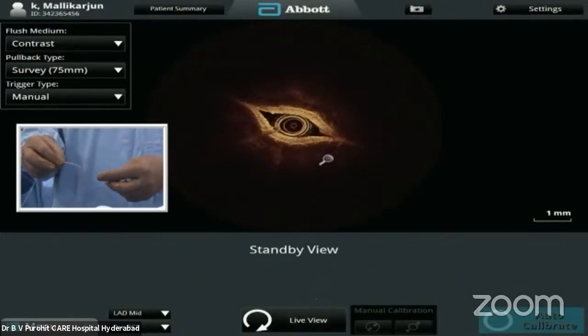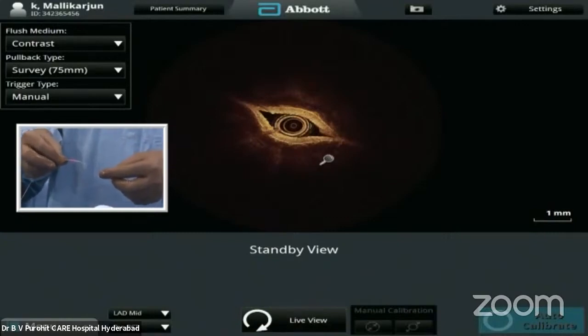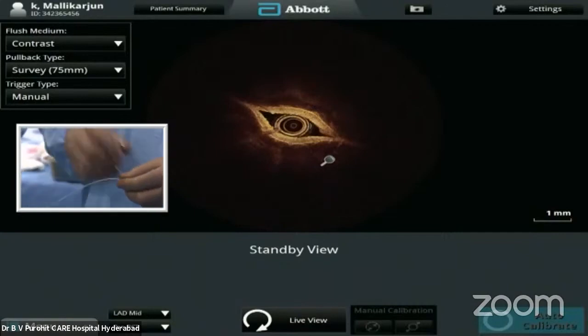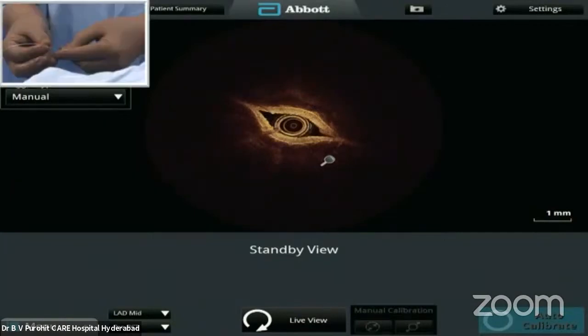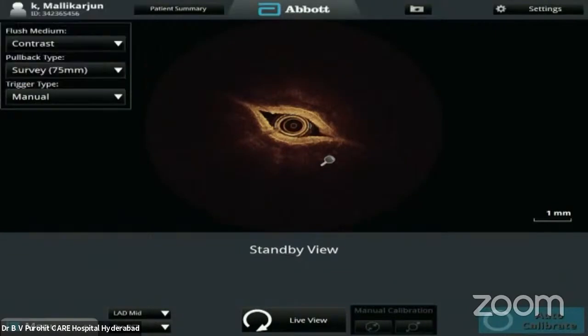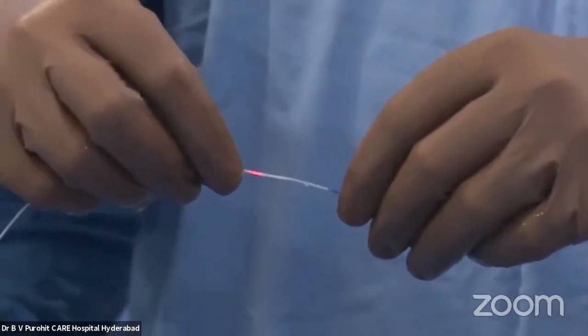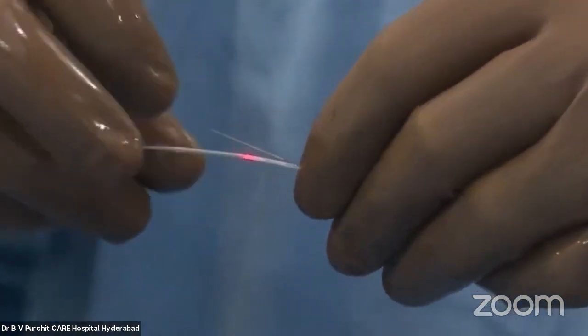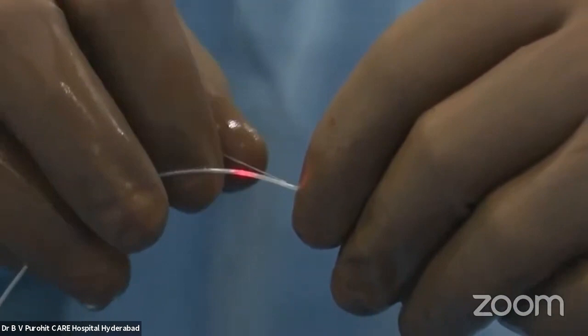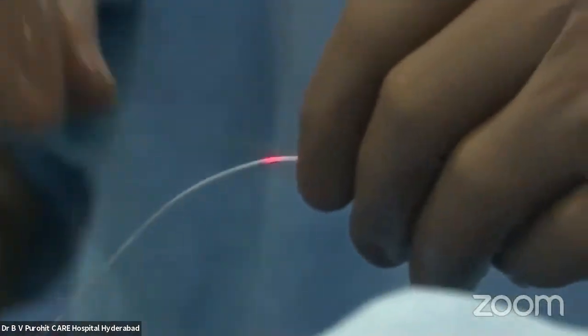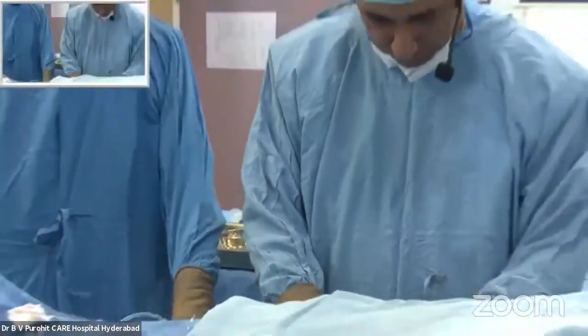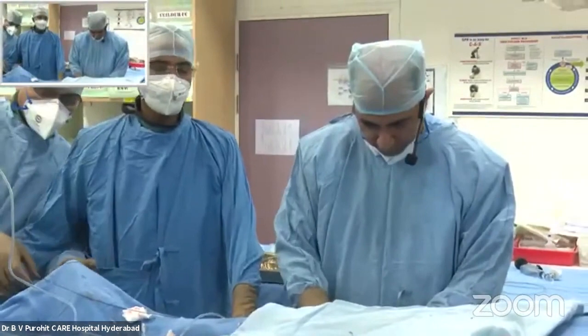Loading the wire is also very important — be careful, as the wire exits just before the lens. If not careful, you may damage the lens. Make a slight bend at the wire exit point so the wire comes out from the side safely. If you don't make this slight bend, the wire may go in straight and cause damage.